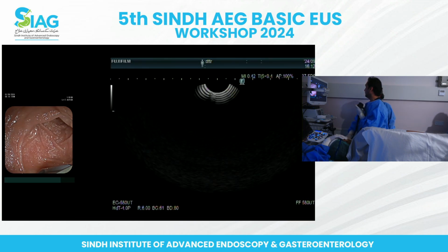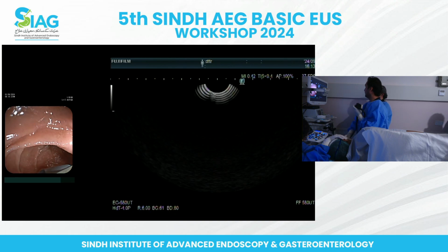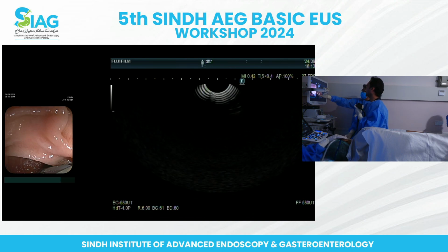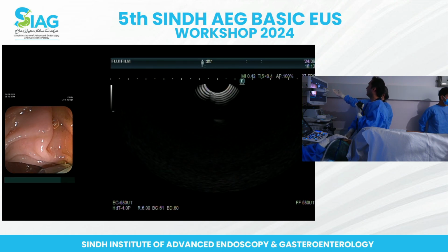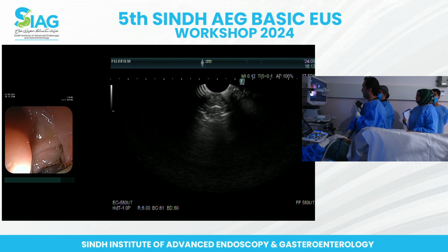Bring it back to the ampulla. That's okay. Ampulla, you'll see EUS-wise as well, but it's always good. Yeah, there it is. This is tracking up. Keep going up. I think it's right in that. So that's the one. Yes, very nice. There it is. Okay, good.